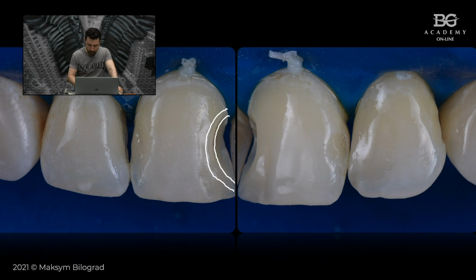Okay, so when I will be using my dentin, I will have to apply dentin a little bit at the beginning of the bevel here, roughly. That will help me to avoid the so-called gray transition. But also what is important is to apply dentin in correct perspective from palatal to buccal side.